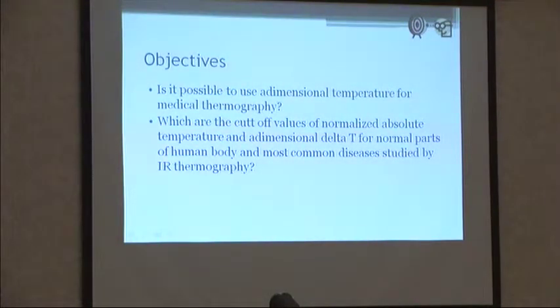We also did delta T from opposite sides for normal parts of the human body and the most common diseases studied by infrared thermography.